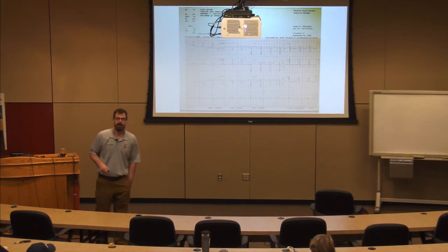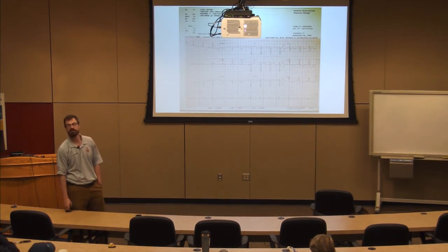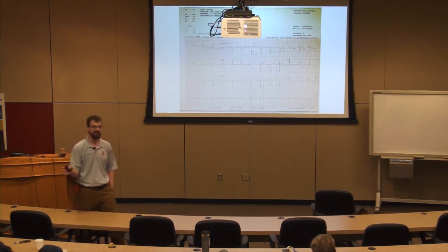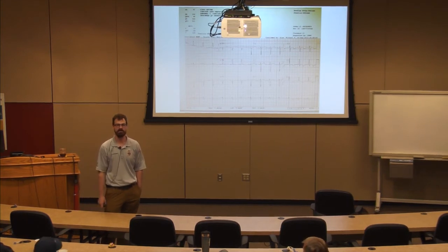Frequency, are we seeing this more and more now? I think it's happening more and more and we're not capturing it. The truth of the matter is, unless it's a big overdose, it's probably not a big deal. But there's a number of cases every year where we get a sudden cardiac arrest. Someone gets resuscitated, they go to the cath lab, they find no other reason other than a long QT, and they stop long QT meds on them.